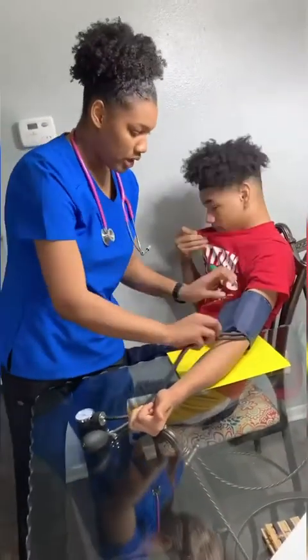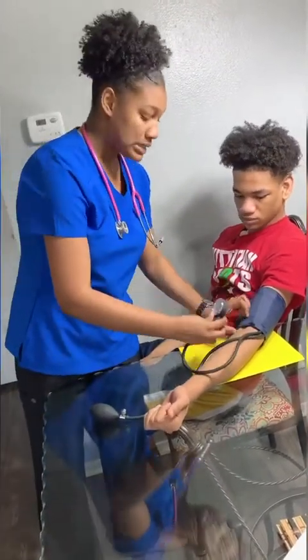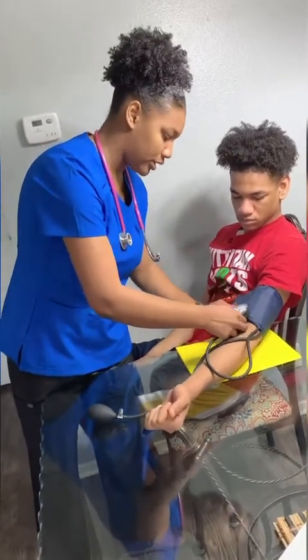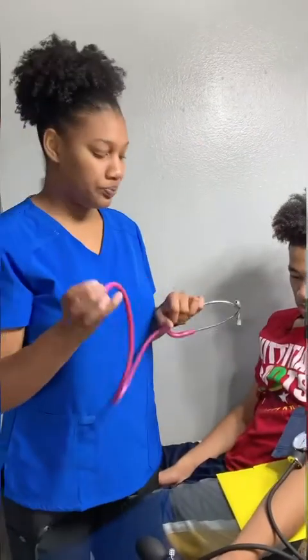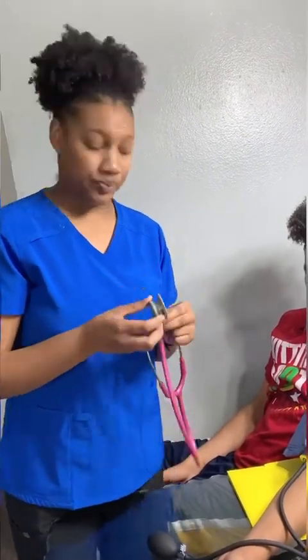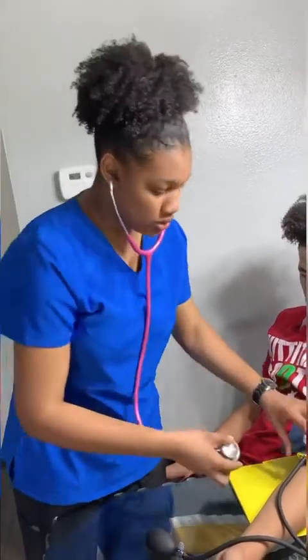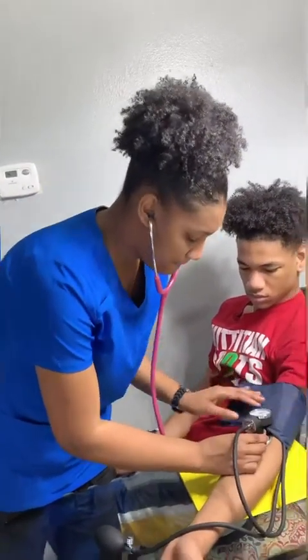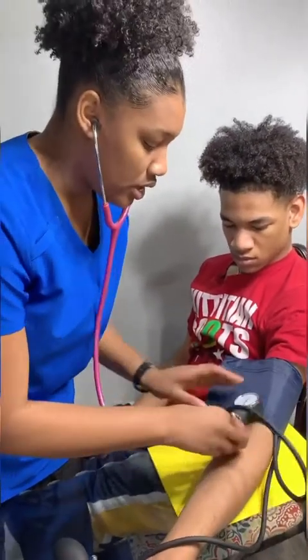Okay, now I want to put the manometer where I can see it to get the reading. Then I am going to use my stethoscope. You could use the bell or the diaphragm to find the brachial pulse. Okay, so I'm going to look for it now. Okay, and I can hear it.